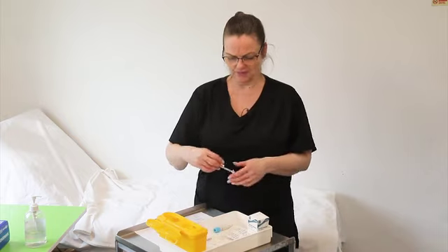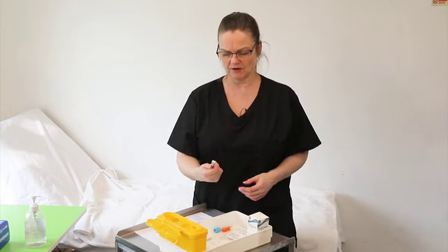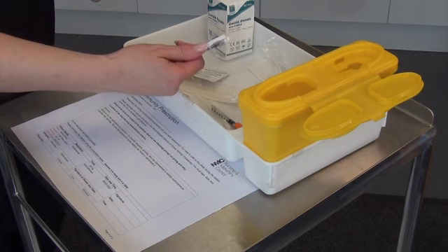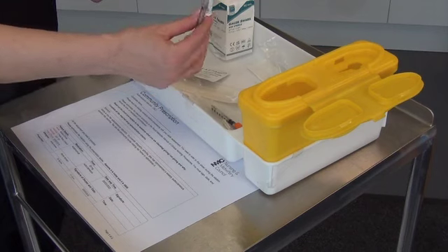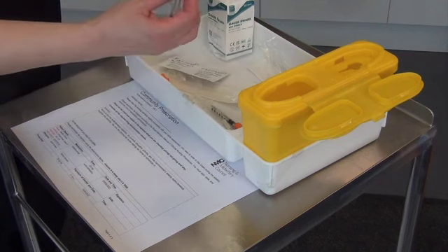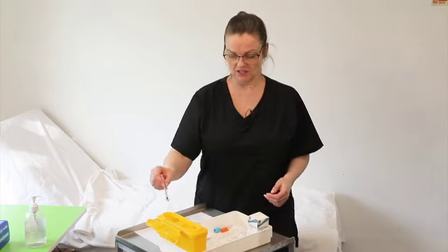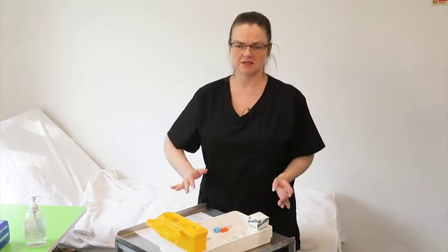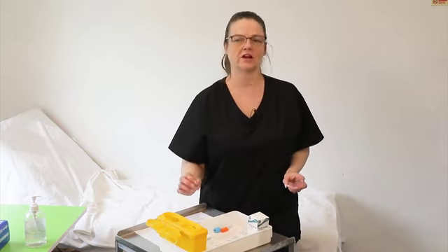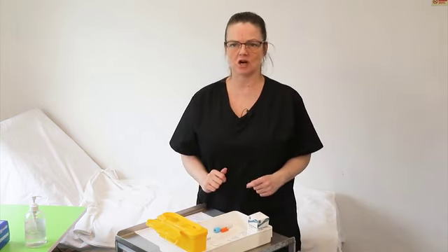The other thing is, these syringes do have safety catches, safety devices on them. These are more modern. So if we push that up after injection, that sharp is now safe and you cannot be injected with that. But the examiner doesn't want to see it in the tray. They want to see it going straight into the sharps bin for safe administration of sharps. So don't put it into the tray, even though in theory it's safe. Put it into the sharps bin, please.